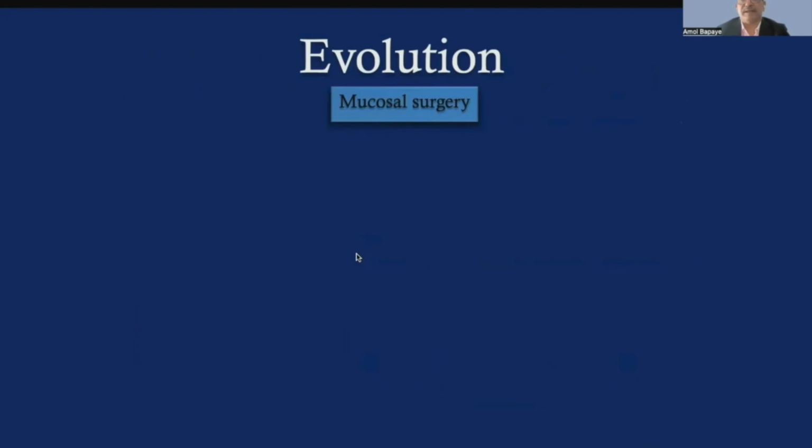And how did all this begin? Mucosal surgery started with polypectomy for pedunculated polyps and went on to endoscopic mucosal resection and endoscopic submucosal dissection for flat lesions and early cancers, and then full thickness resection for other specific lesions.